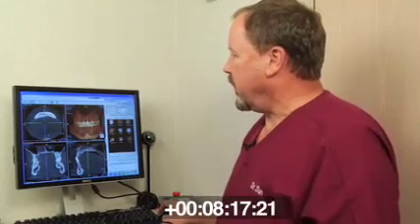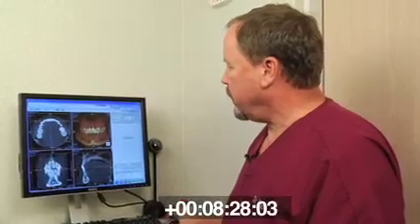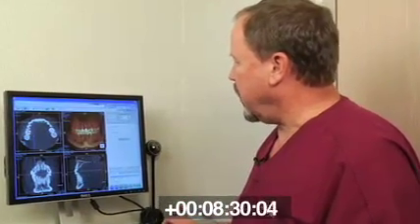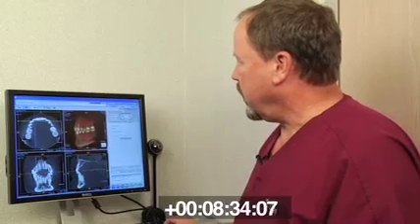We just got Vince out of there. The chair is probably still warm. So here we go head to toe here. And this is back to front, and on this slice side to side. We're also able to look at the 3D image in any plane.